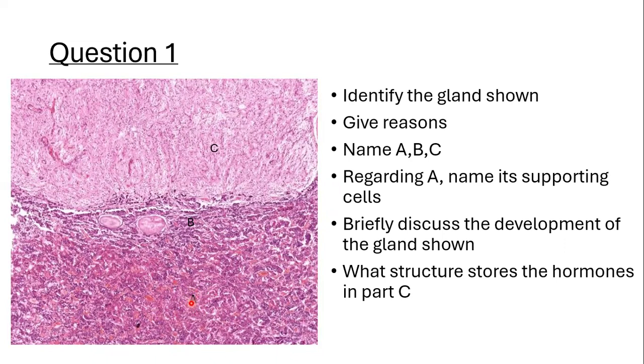Okay. So the adenohypophysis is constituted of pars distalis. What are the other constituents of the adenohypophysis? Pars tuberalis, okay, and pars intermedia, okay. Is there another constituent? So it is pars distalis, tuberalis, and intermedia. So B would be what? Pars intermedia, okay.